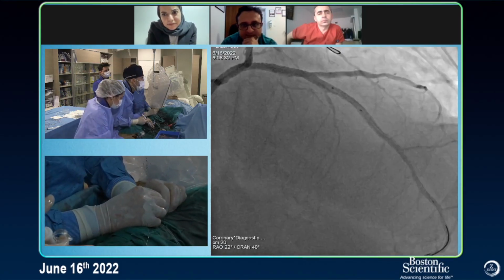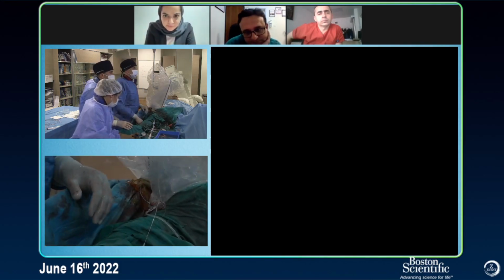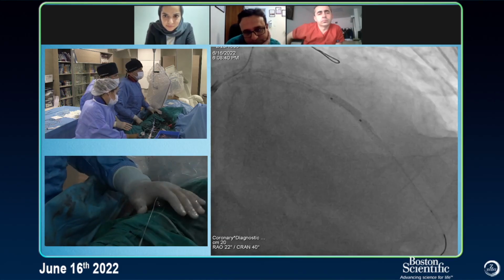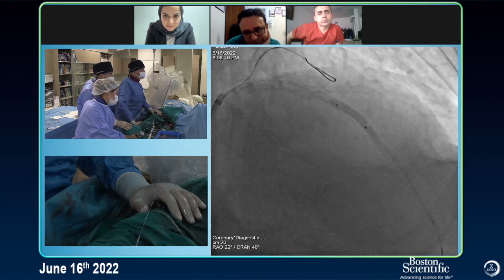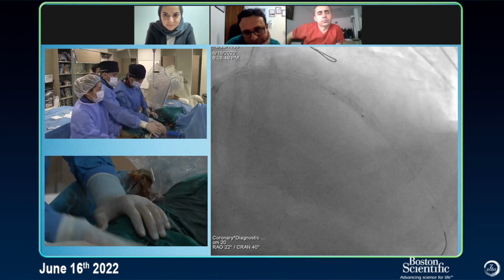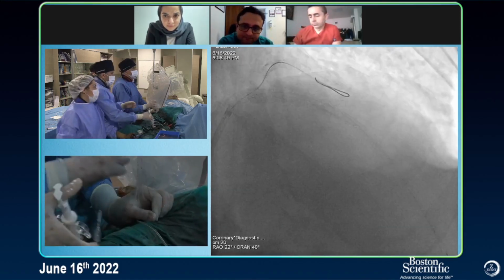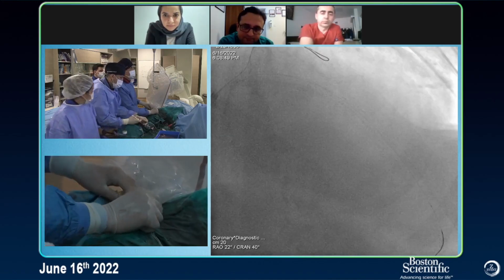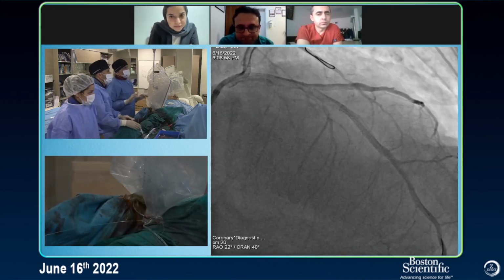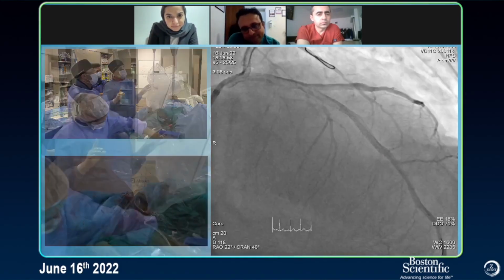Just here. Okay. Go up. Yeah, exactly, yeah, here. Okay, 14. Let's do 14. 10, 12, 14, yeah? 14, 16. Okay, 16. All right. That's good. It's open. Yes, it was good. Hopefully. Let's see. Okay, let's see. Right. Nice, yeah. So I wouldn't go more.